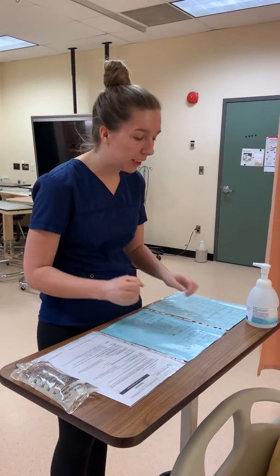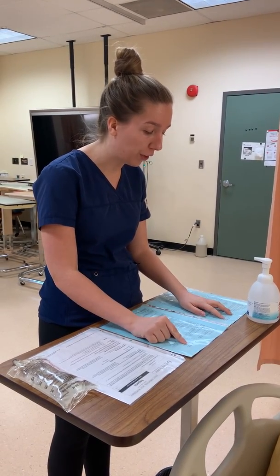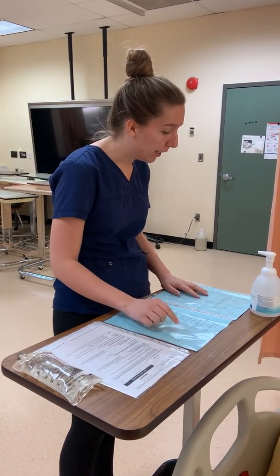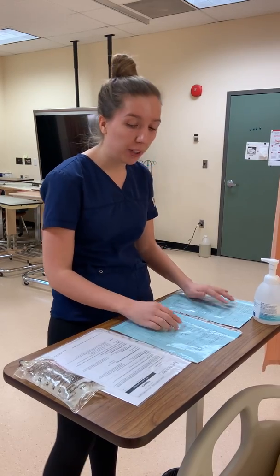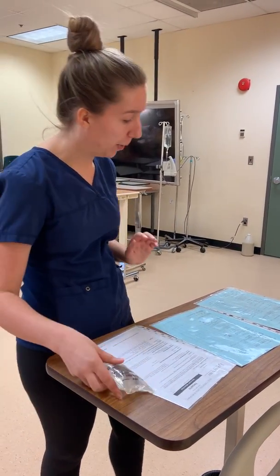So starting with the patient, I see I have Wendy Holmes, FIN number 123, 123, 456, 456, 789, 789. I have the correct patient. I can see that the physician has ordered heparin. As on the MAR, I also see heparin. I have the monograph for heparin, and I pulled the correct medication of heparin. So I have the right medication.